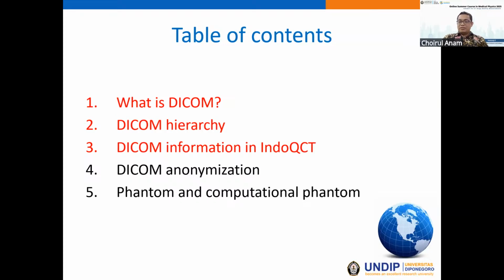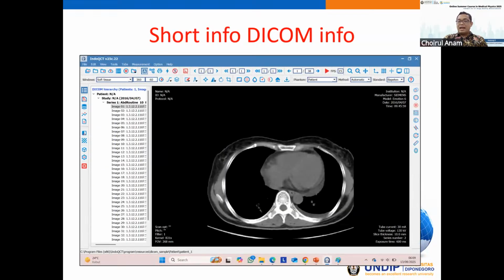So in the IndoQCT, there are many ways to show the DICOM information. I think the basic one is that the information can be displayed as short info in this position. This one is the short info of the DICOM.